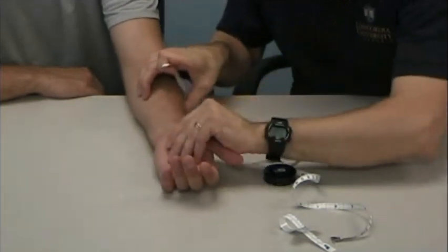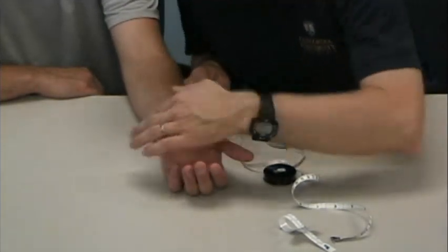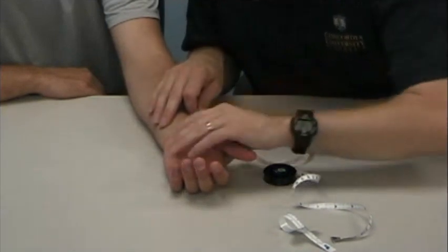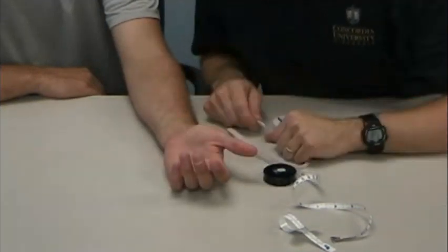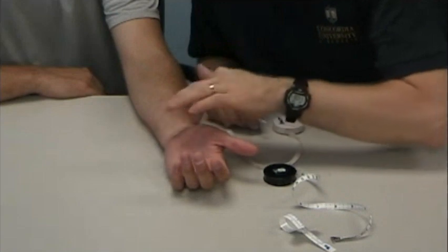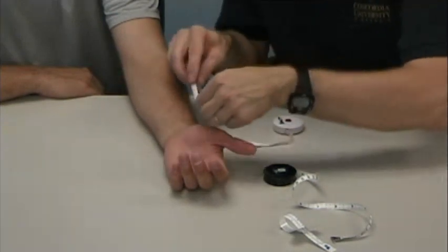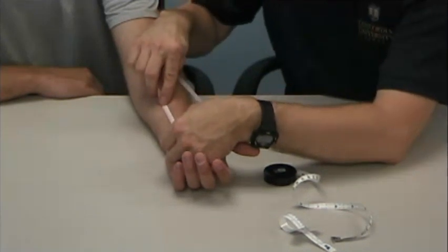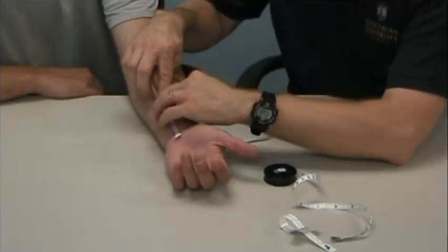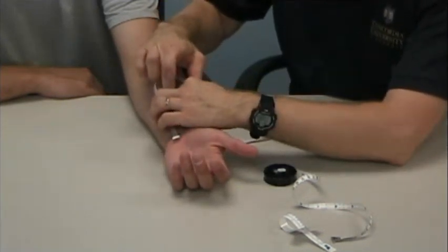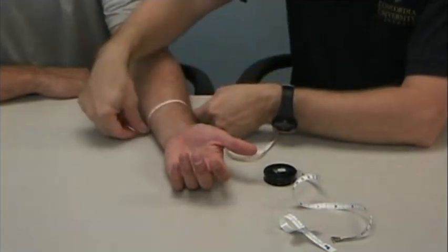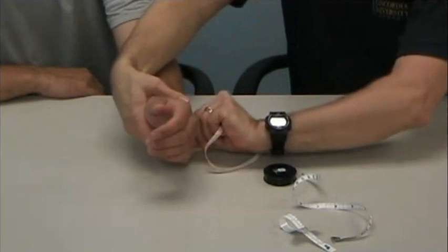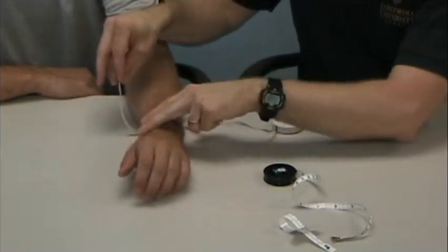For example, I might use his distal wrist crease, which is fairly prominent. His proximal wrist crease is very subtle. So I'd probably use his distal wrist crease and then say, I'm going to measure 10 centimeters proximal to his distal wrist crease. I would actually use a pen to mark that and then measure around there. So it's a fairly quick, fairly easy way to get a measurement of edema.